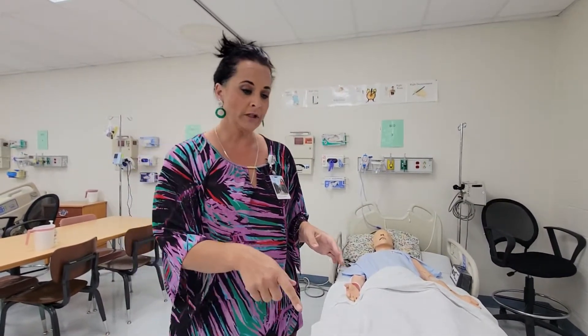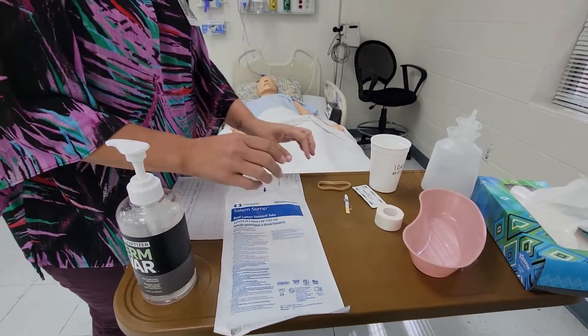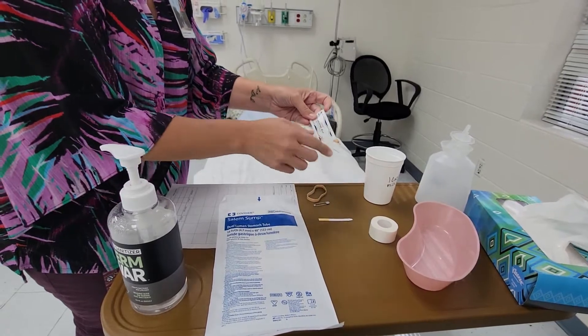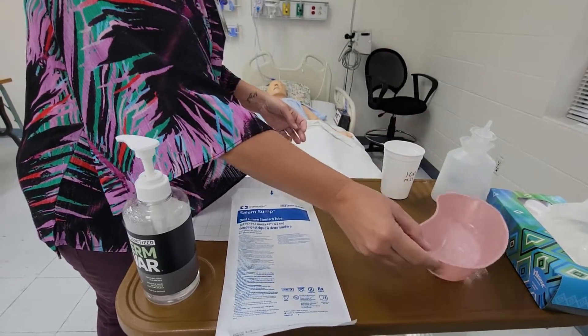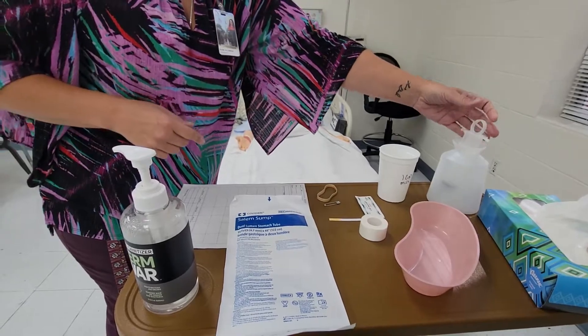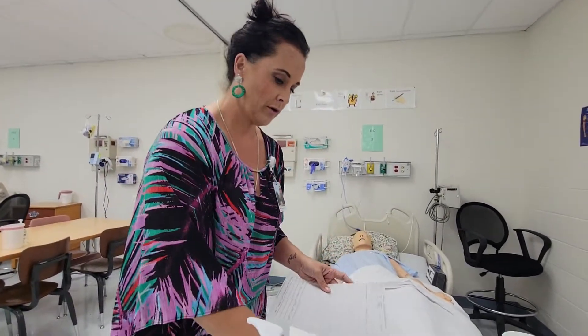Today I'm going to talk about doing a nasogastric tube insertion, or NG tube as we call it. First we're going to look at our supplies: your salem sump NG tube, a rubber band and paper clip, pH paper, lubricating jelly, tape, a cup with water, your emesis basin, tissue, and a syringe. You'll also be starting with doctor's orders, and I'll show you how we use those.